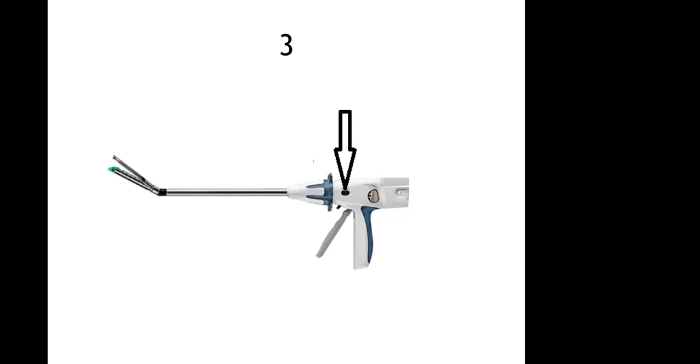The cartridge house is closed, and then with every firing the number changes to 1, 2, 3, 4. 1 means 25% of the length that would be cut by this stapler and cutter has been cut. When the number is 2, 50% has been cut. When it is 3, 75% of the length has been cut. And when it is 4, the entire length has been cut. When you fire again, it comes back to 0, which means you can now disengage the stapling head.